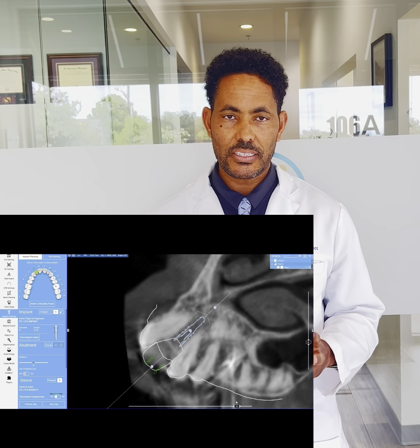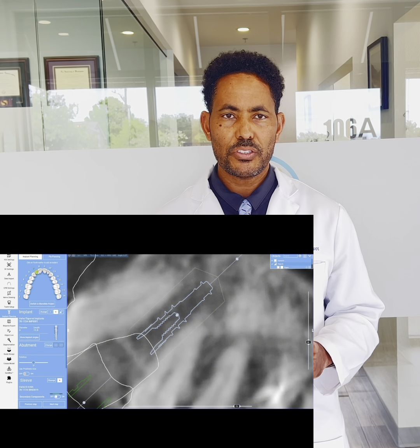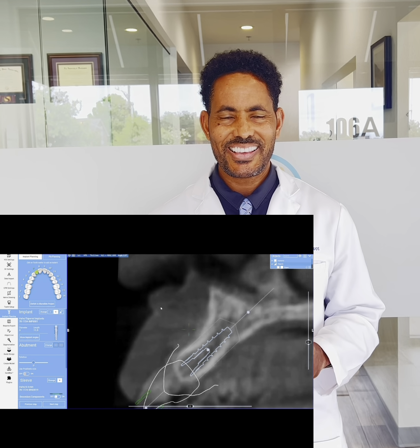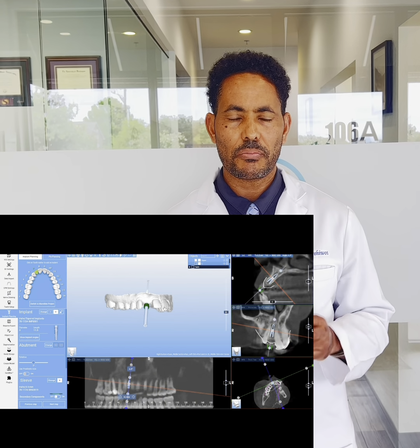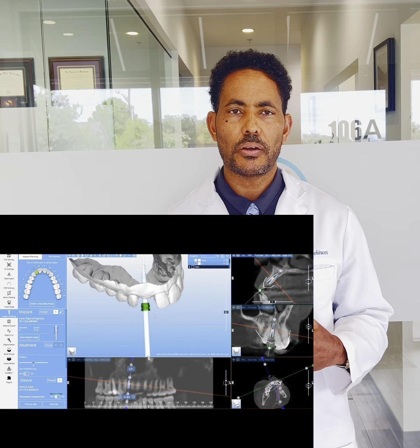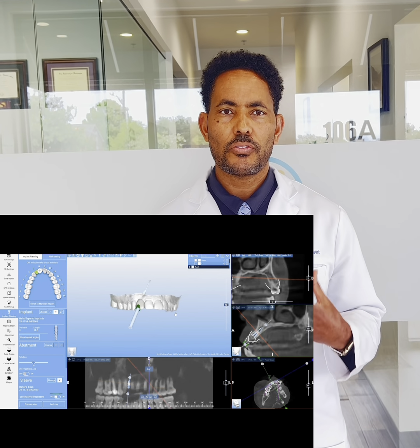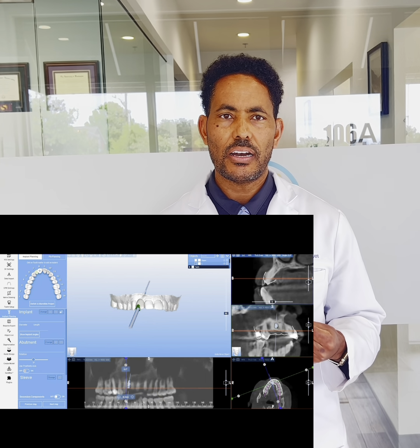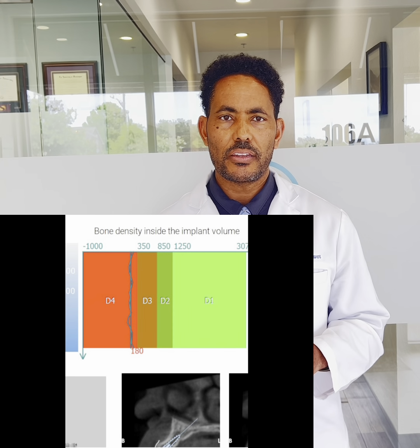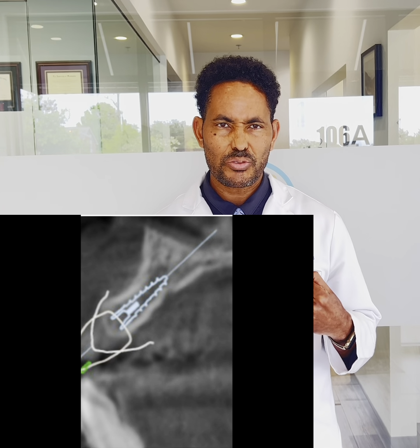As you can see in the picture here, there's the missing tooth, and you can see the thickness of the bone. By ridge augmentation, my goal is to make the ridge reasonably acceptable for an implant so that we can have a nice prosthetically driven crown. That's it. This is what I'm doing, and I'm going to walk you through step by step the steps we take.